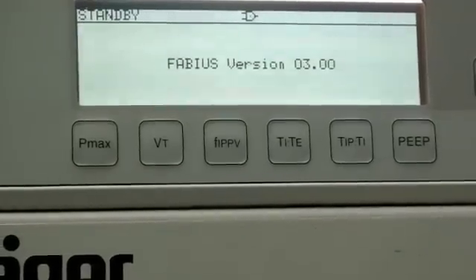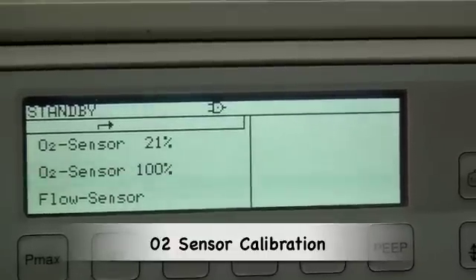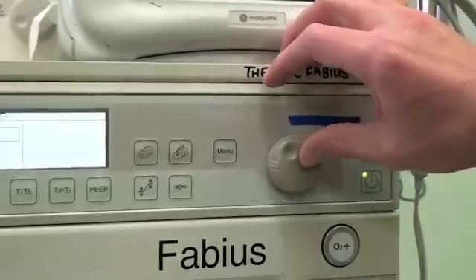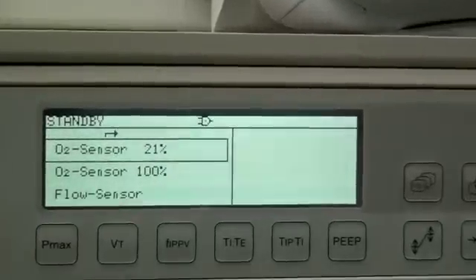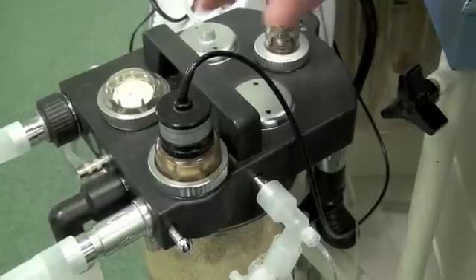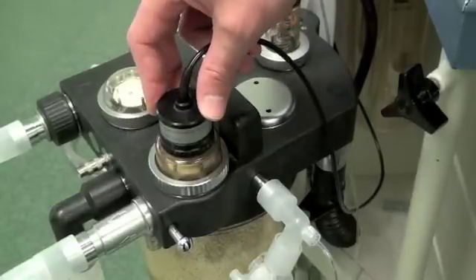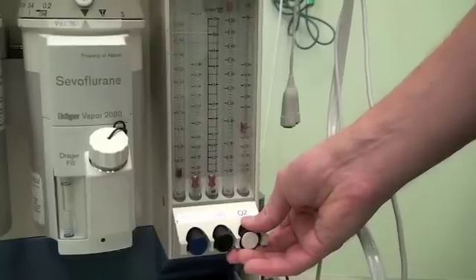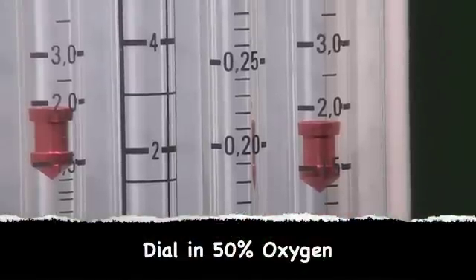Part of the gas check is to calibrate your oxygen sensor. The oxygen sensor can be calibrated to room air at 21% or to 100% oxygen. To calibrate to room air, select the O2 sensor at 21% and turn on the medical air. The oxygen sensor is located at the inspiratory portion of the breathing circuit. A tick now indicates that the oxygen sensor is calibrated to 21%. The last part of checking the gas supply is to confirm that it is actually oxygen being delivered by dialing in a set concentration and verifying the oxygen sensor reads that concentration.